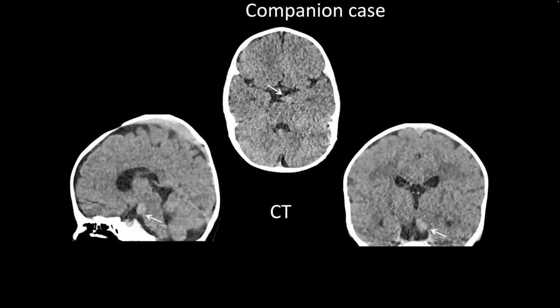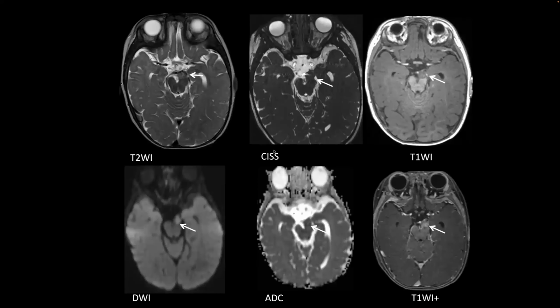As Dr. Vivek had shared the case, I remember one of these cases seen a couple of years back. This was a 6-month-old child. Similar imaging features, non-contrast CT and hyperdense lesion. These are non-contrast MR sequences on the first two panels. Again, similar appearance of the lesion, restricted diffusion. On post-contrast, there was some degree of enhancement.